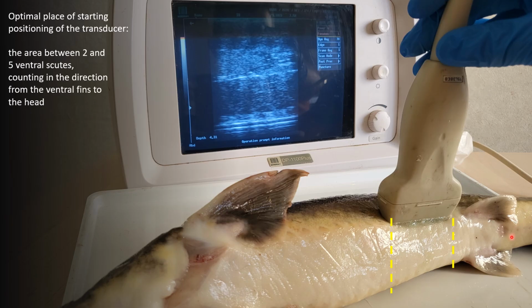The optimal place for the initial placement of the transducer is the edge of the lateral surface of the body, in the area of 2 to 5 scutes from the pelvic fins, counting towards the head. We marked it on the photo with a yellow dotted line. This is the extreme position of the transducer on the tail side.